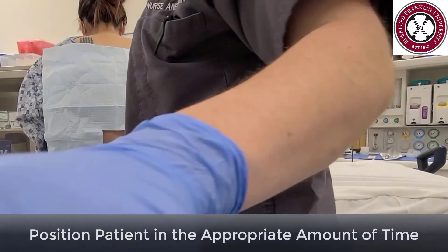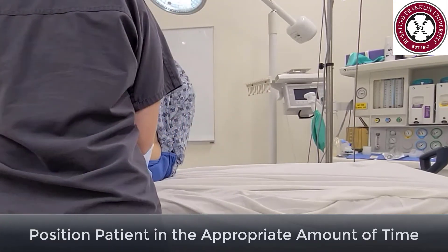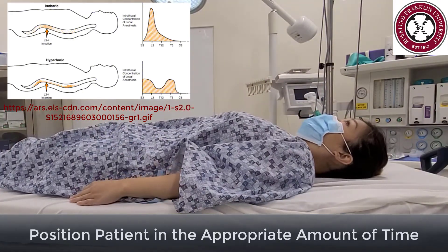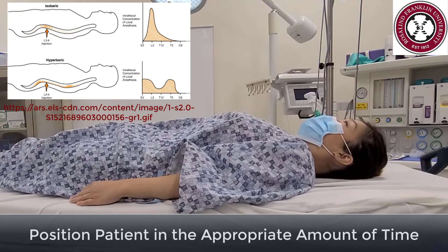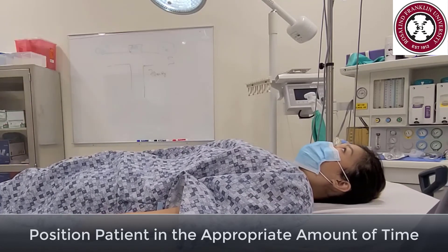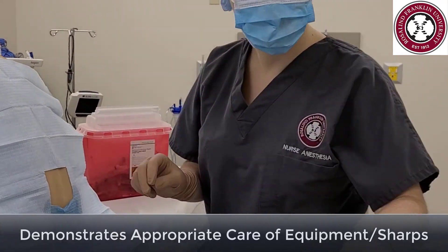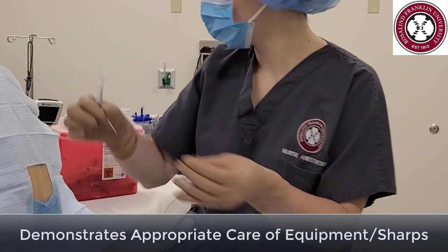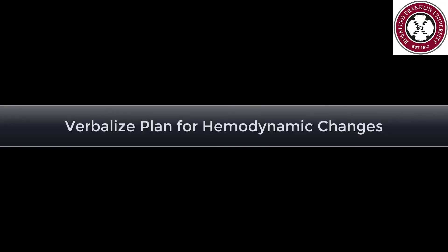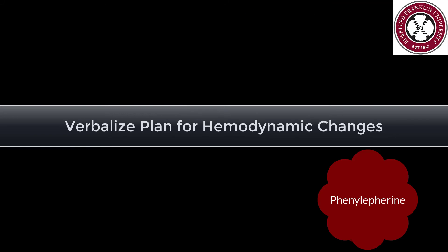The type of block you wish to have will determine when you reposition the patient. The baricity of the local anesthetic and the patient's position will determine the spread of the local anesthetic. Placing the patient in Trendelenburg position will increase the cephalad spread, while reverse Trendelenburg will slow the cephalad spread. Appropriately dispose of all equipment and sharps. Be ready to verbalize your plan for hemodynamic changes including IV fluid, ephedrine, glycopyrrolate, and phenylephrine.